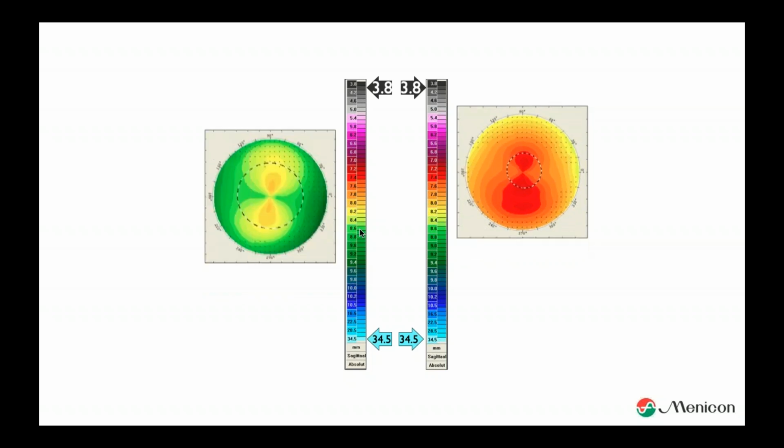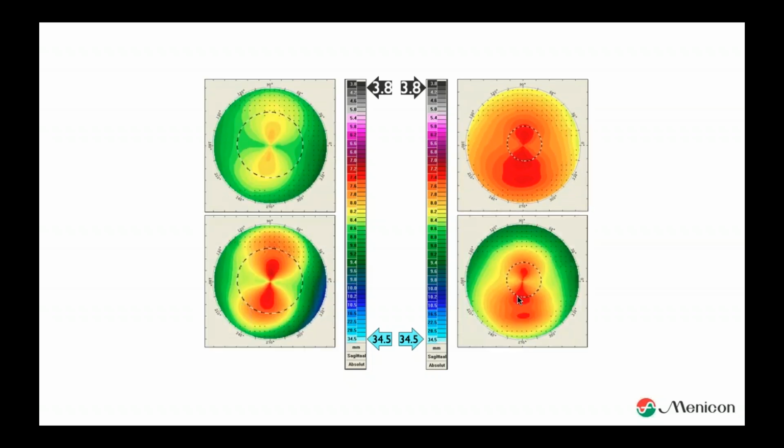So to keep it clear, in a relative scaling the scaling is adjusting to the image, and in an absolute scaling the image itself is adjusting to the scaling, typically the opposite. And both of them are useful, but you can better use the bottom one in your practice most of the time.